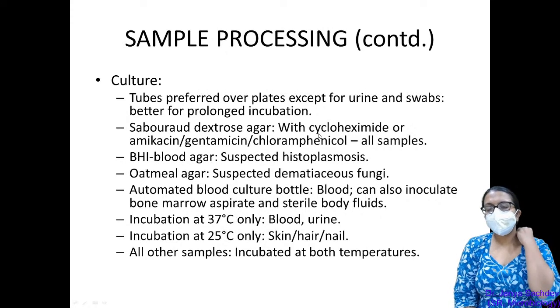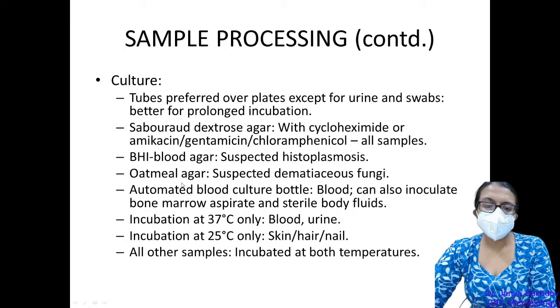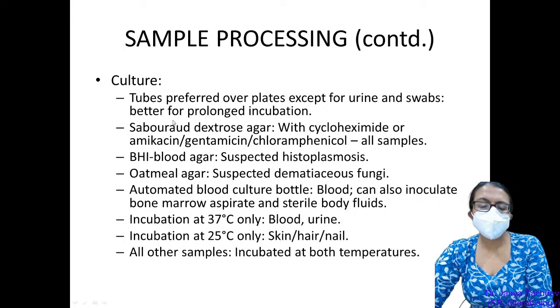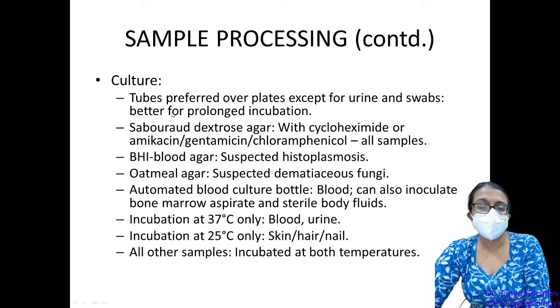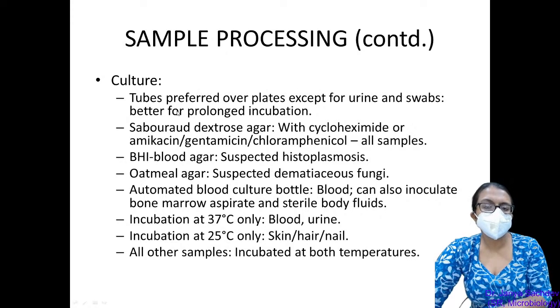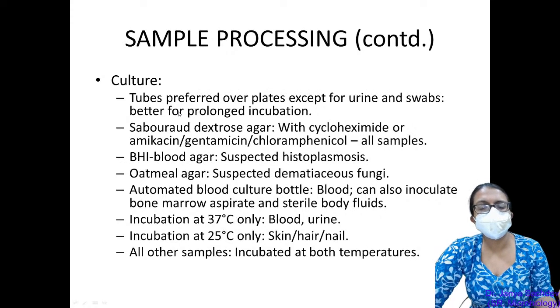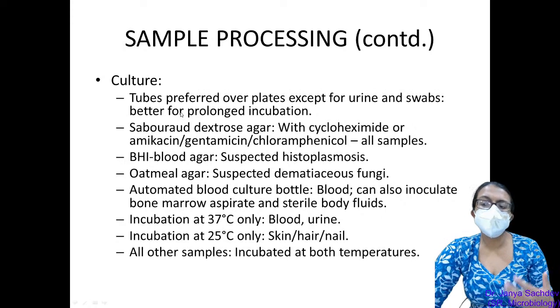So once we've done our direct microscopy, we proceed to culture. Culture is done on a variety of media. Generally speaking, in mycology, because fungi take so long to appear in culture and we have to incubate the media for weeks or even up to a month in certain samples, the problem with plates is that they have a very large surface area, so the media dries and desiccates very quickly. And because of the large surface area, they are more amenable to contamination and pose a risk to the person who is handling the sample.